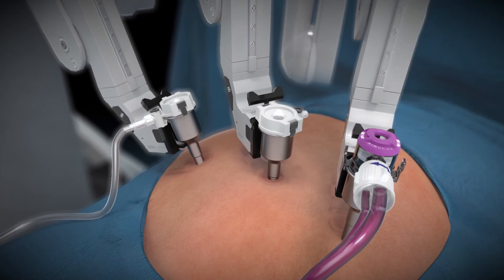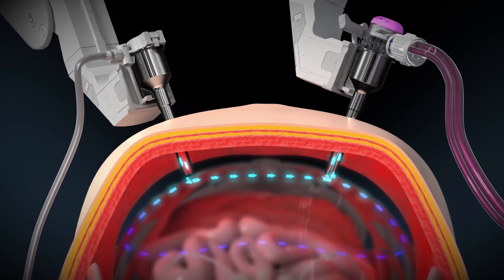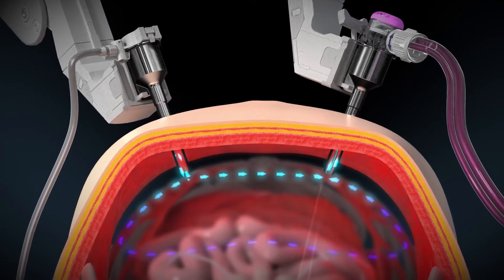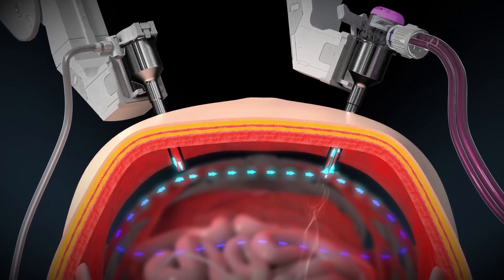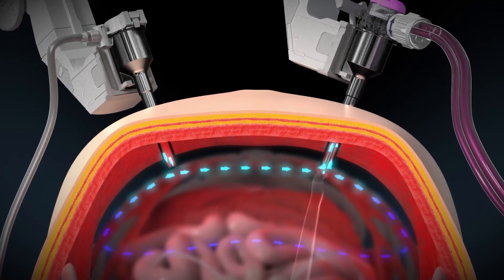The instruments can now be loaded and the procedure can begin. Throughout the procedure, the system will actively insufflate through the clear lumen while evacuating smoke and maintaining the AirSeal pressure barrier through the AirSeal cannula cap.